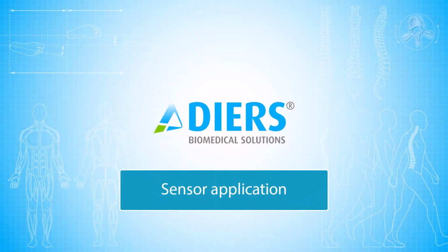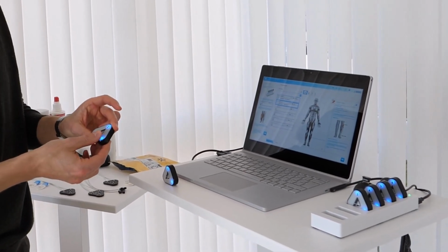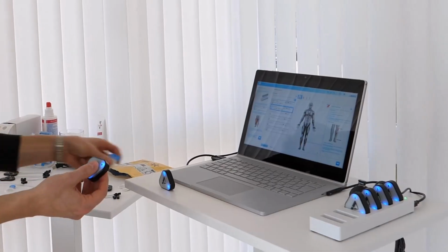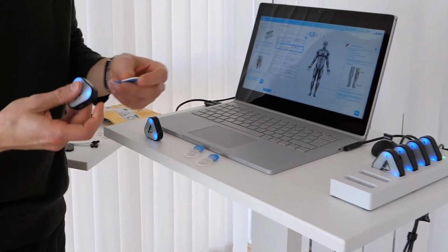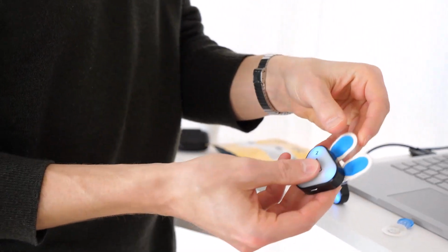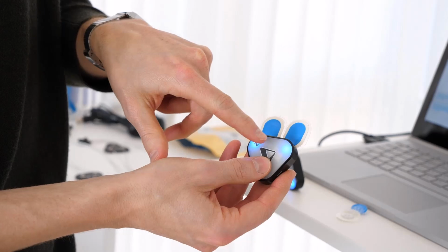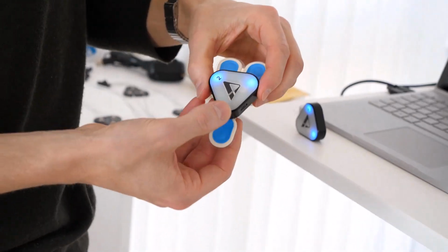In the next step, we move on to the definition of the electrodes and their positioning. In our sample, we have assigned sensor 2 to the tibialis anterior on the left. To perform the measurement, we need 3 electrodes. We first apply these to the sensor. This is the simplest method in this system. We have 2 electrodes coming to the lighted LEDs and 1 electrode pointing exactly opposite. The latter is the reference electrode.